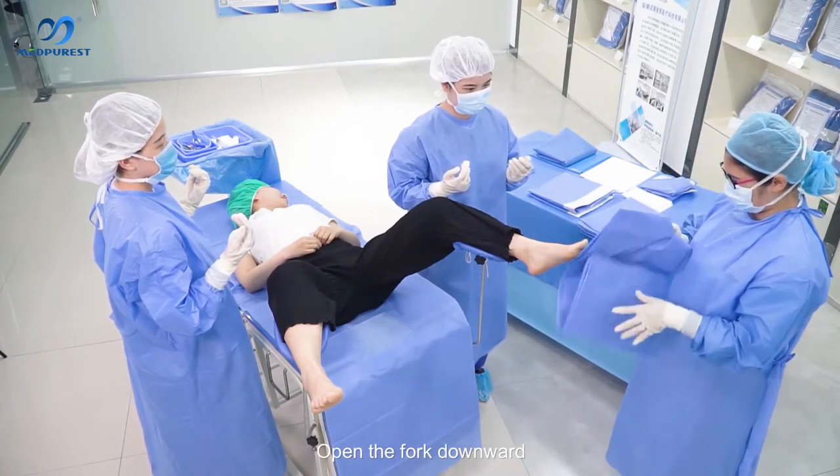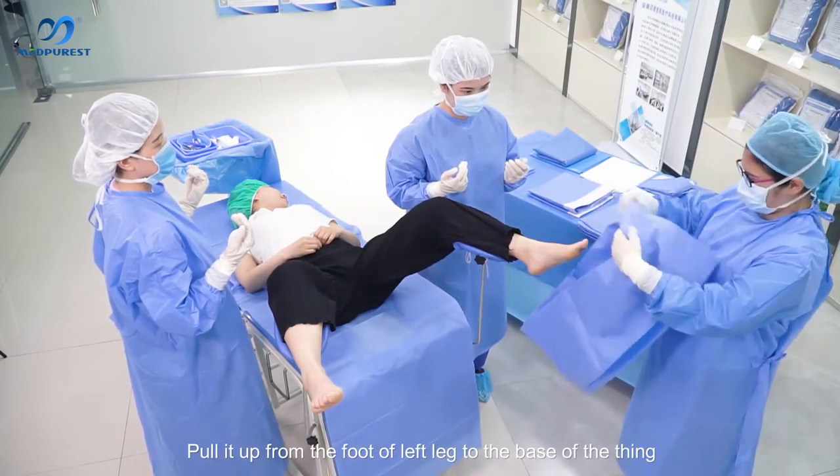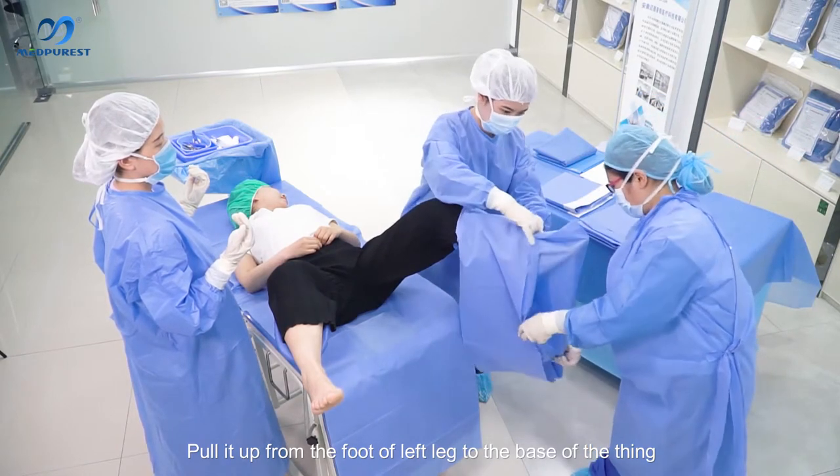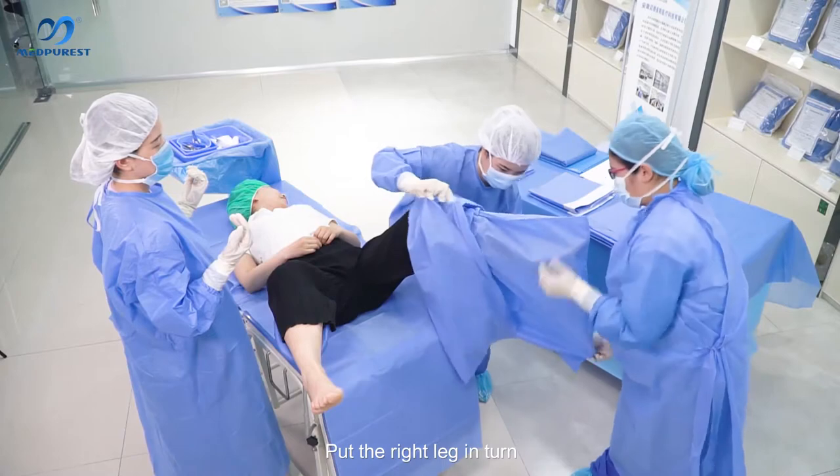Pick up the legging and open the fork downward. Pull it up from the foot of the left leg to the base of the seam, then put the right leg in turn.